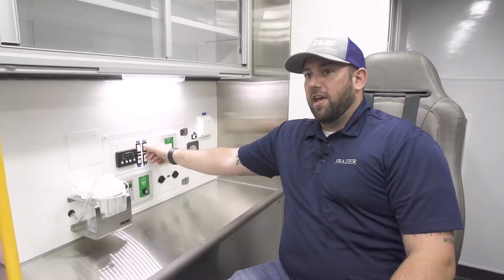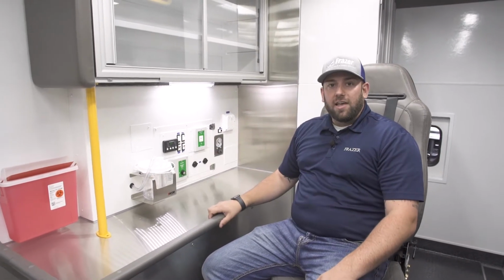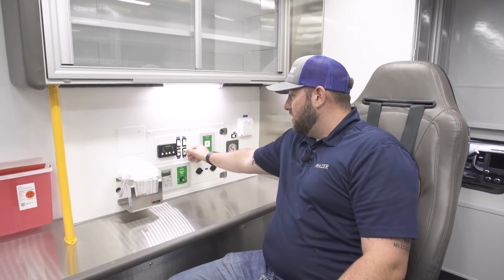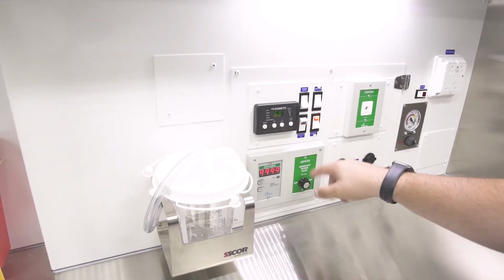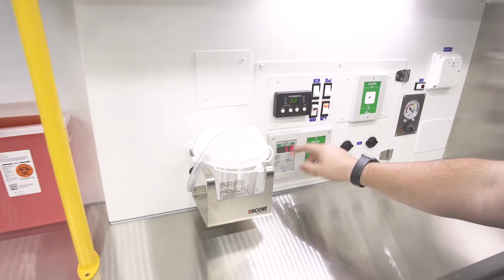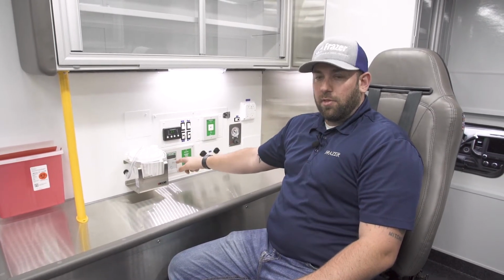You can control things like your interior lights, the ventilation fan or the exhaust fan at the rear of the unit. And then this unit actually has electric O2. It comes with an electric regulator that goes on the main O2 bottle. You can simply switch the regulator on and off, which will turn on and off oxygen flow at the bottle, and then it'll cycle through this test. When the bottle is hooked up, it will show you the PSI of the main bottle. When the bottle gets low, it gives you that low PSI alarm like we just saw.